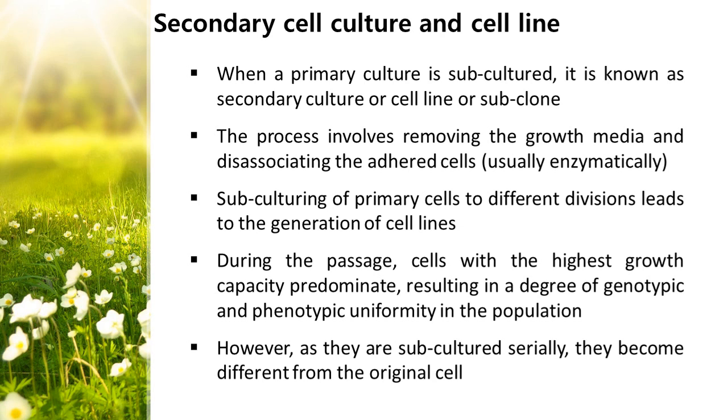So there is a chance to become different from the original parent cell. During the passage, they try to carry the genotypic and phenotypic features. It represents the morphological similarity. So morphological similarity or genetical similarity, they try to maintain.